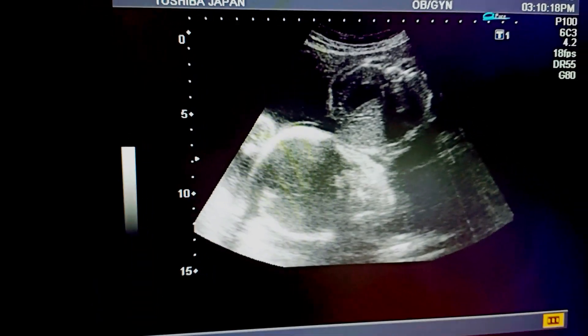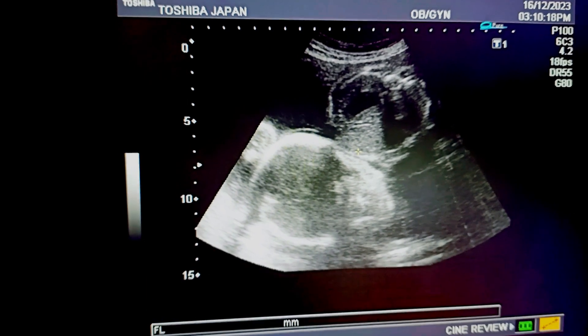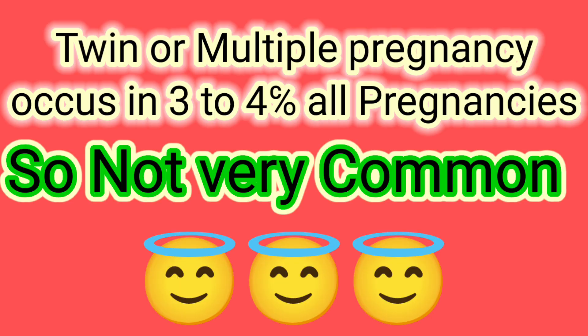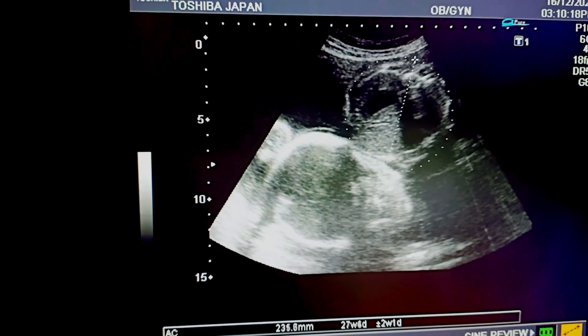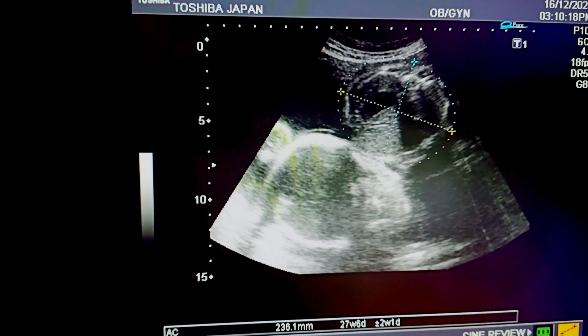To calculate the fetal age, we will also measure the femur length. Twin or multiple pregnancies occur in three to four percent of all pregnancies, so it is not very common but it does occur in three to four pregnancies out of every 100.